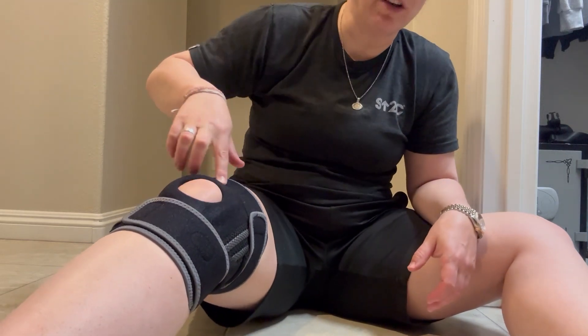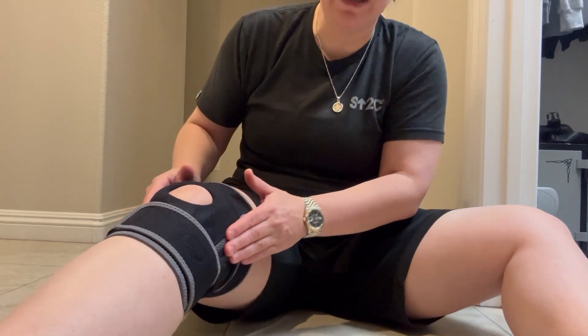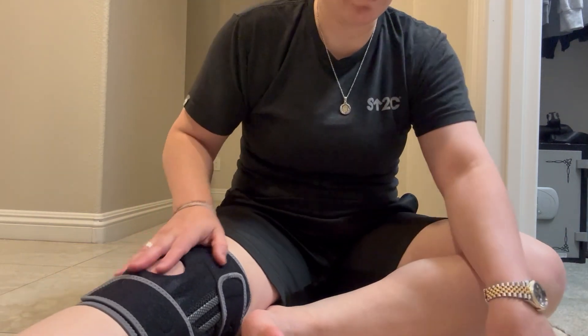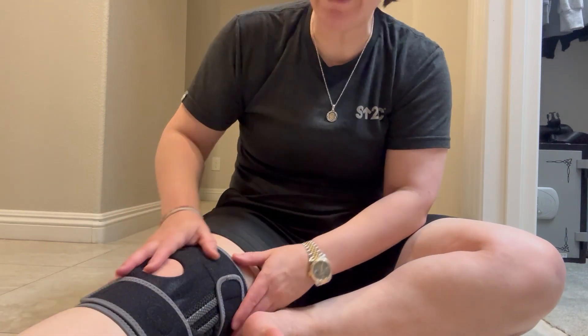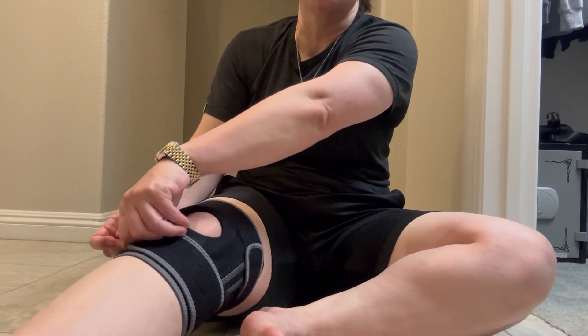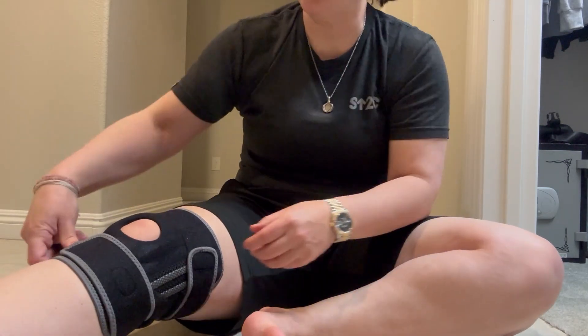The Patella gel pad and side stabilizers have been really, really terrific for me as well. It's a breathable lightweight fabric, which is also really nice. And then you have those four adjustable straps that I already showed you.